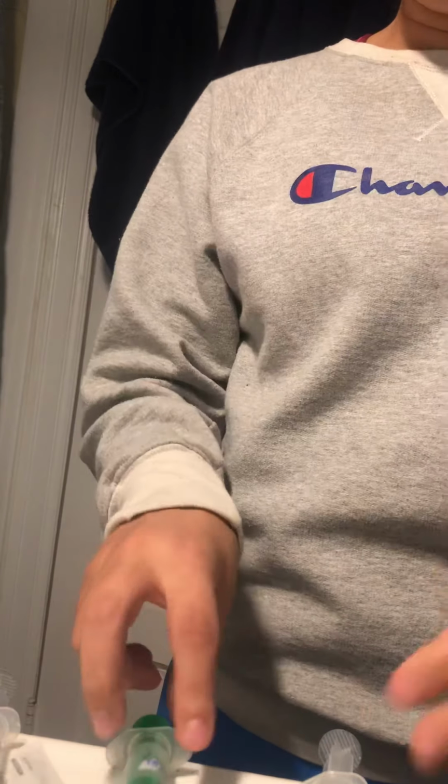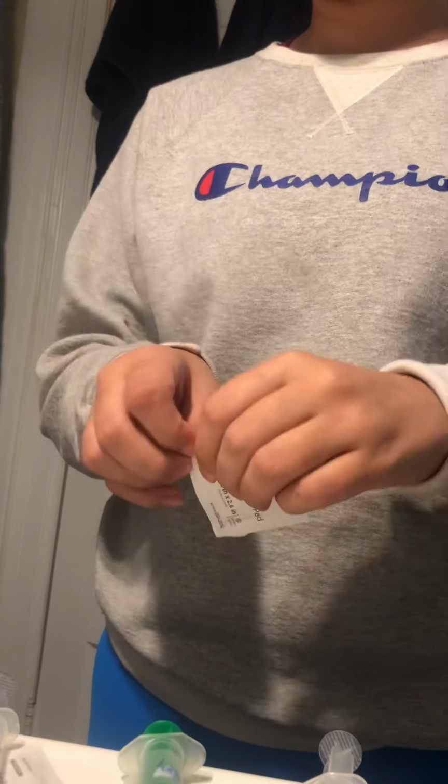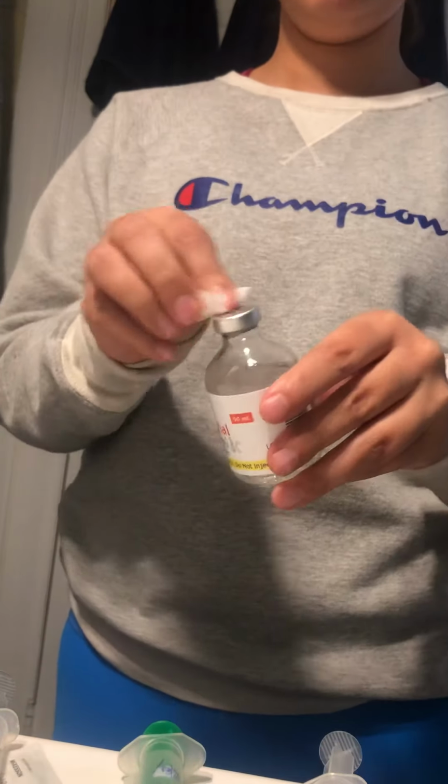So we're going to draw up our Lasix. We're going to take the alcohol swab, again cleaning the vial. We're going to put 2 milliliters of air in because that was the doctor's order.